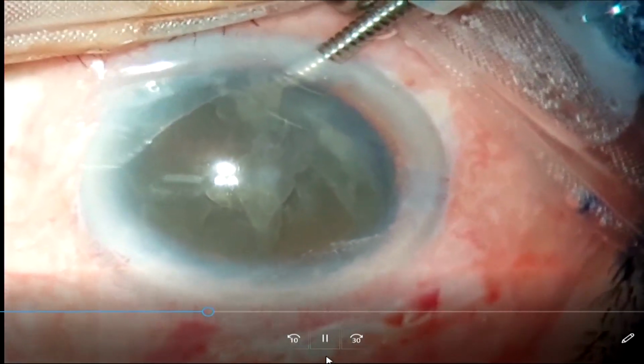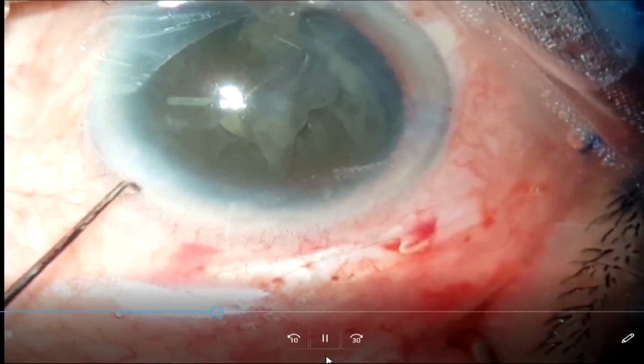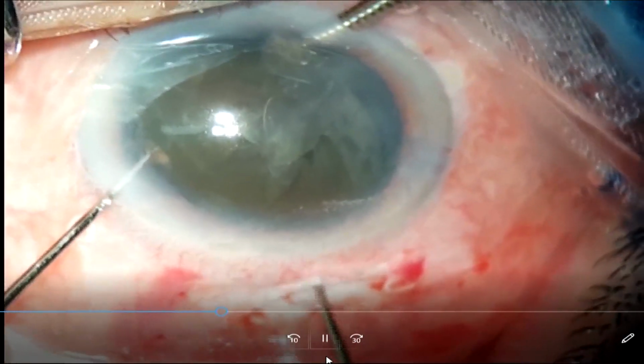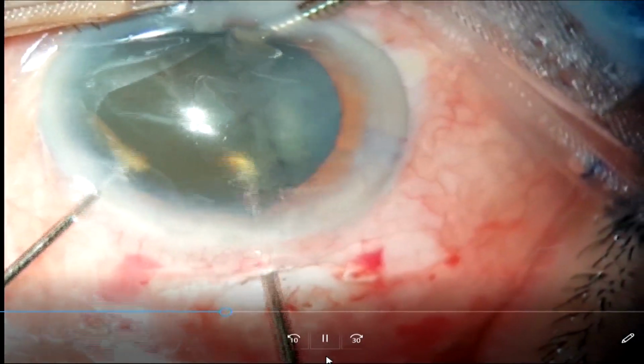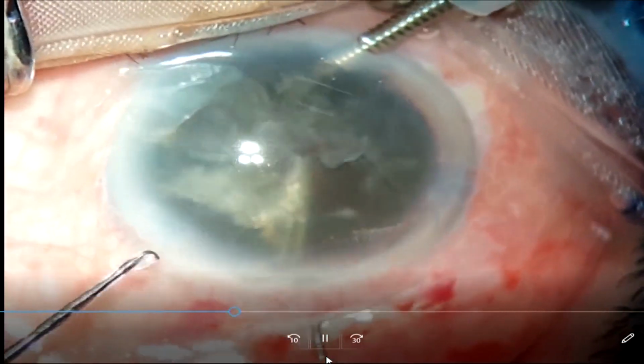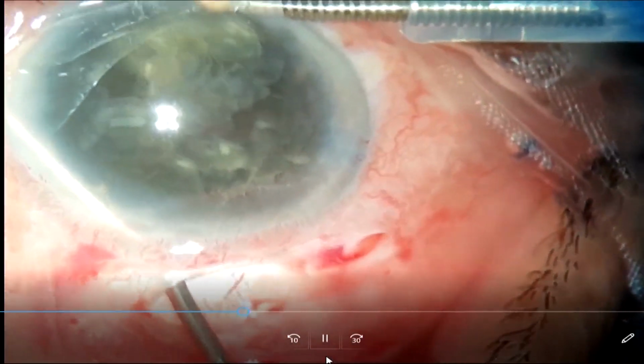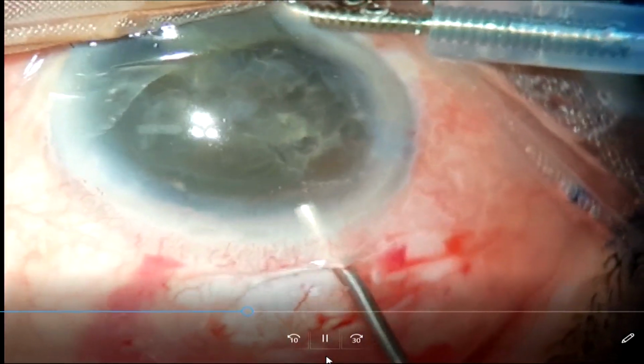You can also use other techniques like the hand over hand maneuver. This is now the hand over hand maneuver being used to prolapse the nucleus out. It is a large nucleus with a slightly smaller rhexis than what was required. So this maneuver helps. And again, lots of viscoelastic in front.